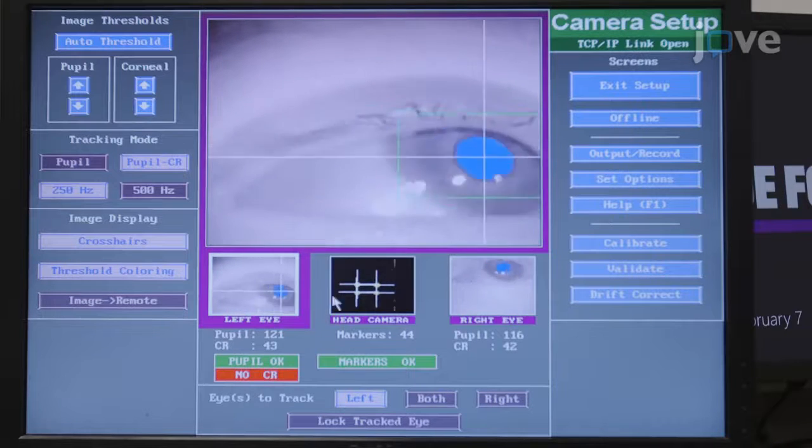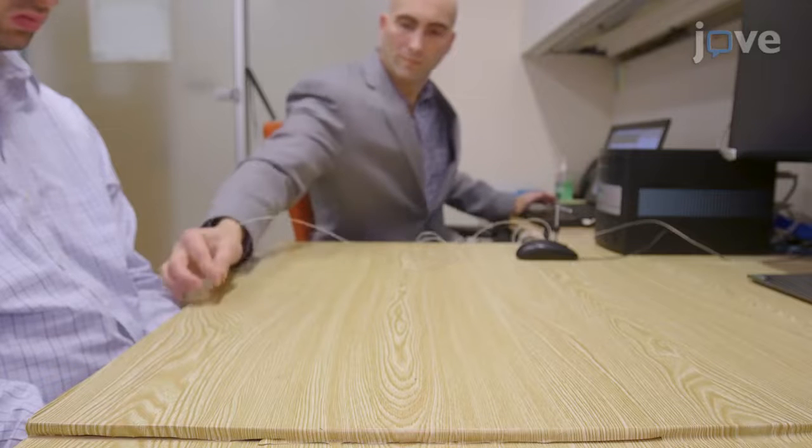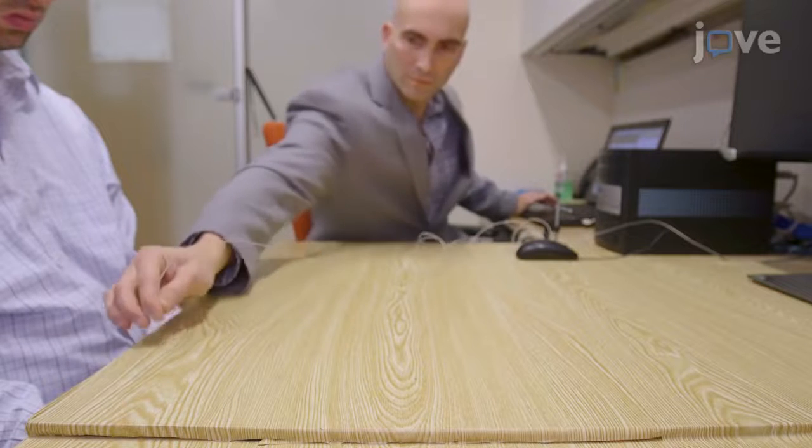Here we will use this to compare patients with chronic middle cerebral artery or MCA stroke to healthy controls. The objective analysis of eye movements and the characterization of motor control have been proven to assist in disease detection, monitoring, and prognosis in the setting of brain injury, thus serving as techniques to monitor physiologic phenotype. Here, we combine the biomarker potential for a maximized effect.